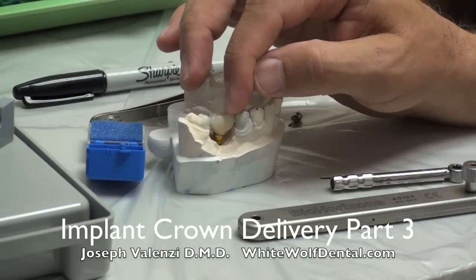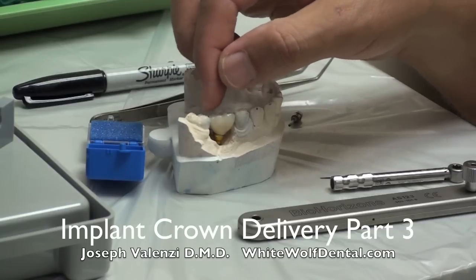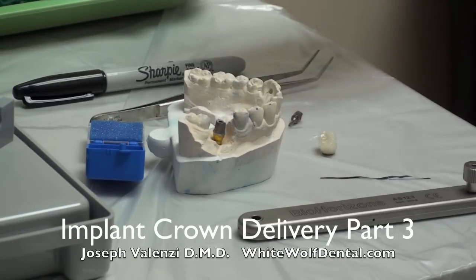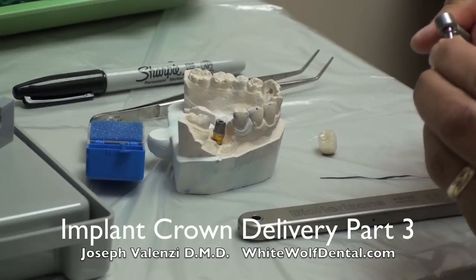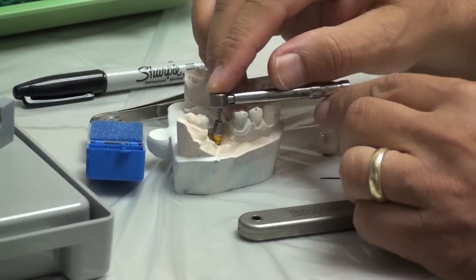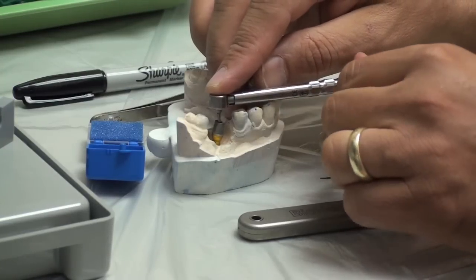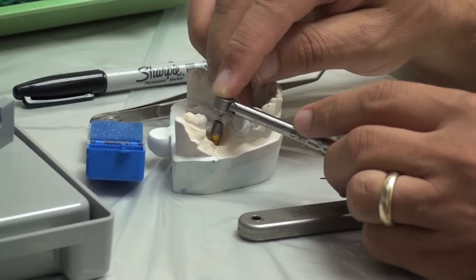It looks like it's going and things are roughly correct. Work on the contacts - you know the sequence for the contacts - and get that approximately correct. Before you get it fine-tuned, let's torque this down now. So we go to our torque wrench, put it in here. I'm having a little trouble here with the torque wrench because these teeth are forcing me to put it at an incorrect angle, so I'm putting it off to the side so that I can get it down there and feel it completely seated.